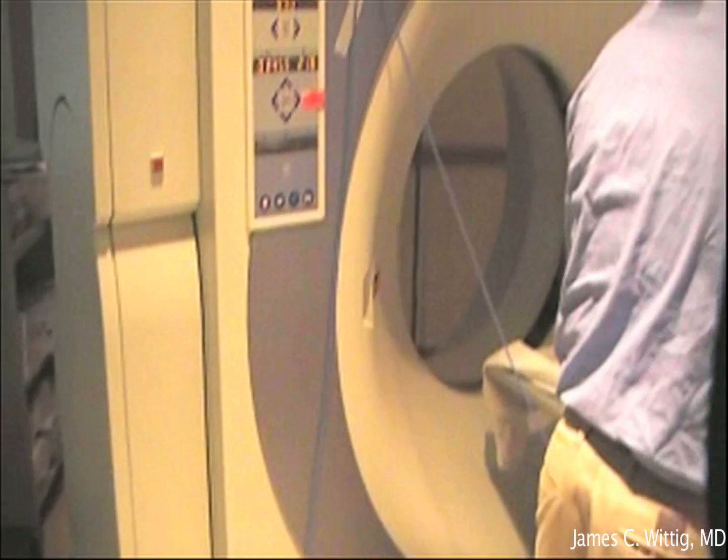An osteoid osteoma is a benign, very painful tumor that develops in bones. Radiofrequency ablation is a minimally invasive procedure designed to eradicate the tumor.